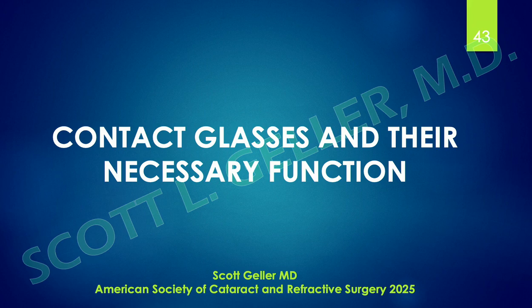I'm not sure every ophthalmologist in training really understands the nitty-gritty of contact glasses. It's extremely important in working in the vitreous because it's the contact glass that allows you to work 3 to 4 millimeters from the surface of the retina safely and 1 to 2 millimeters from the capsule of a phakic patient.